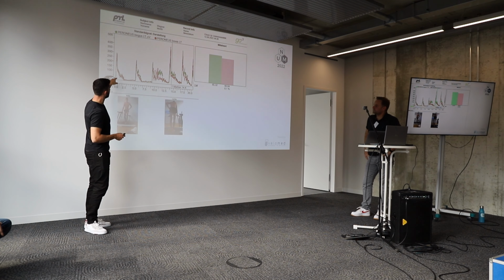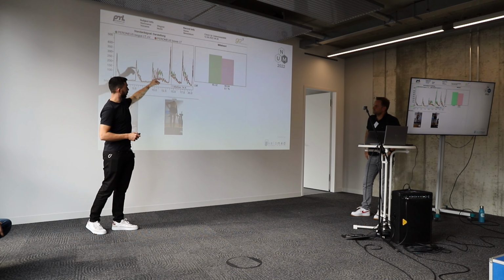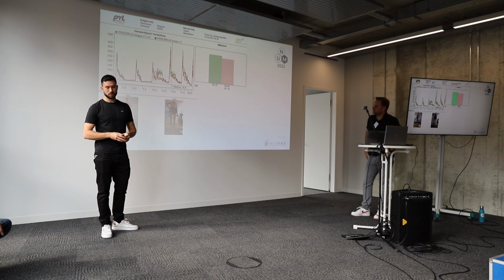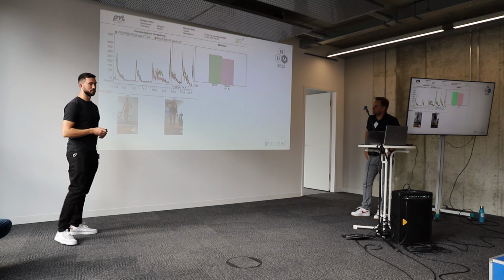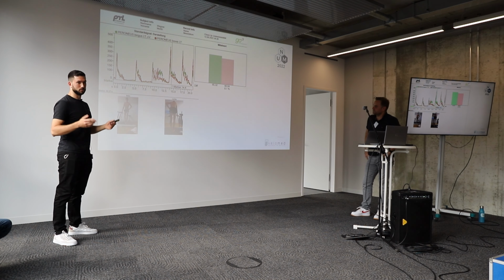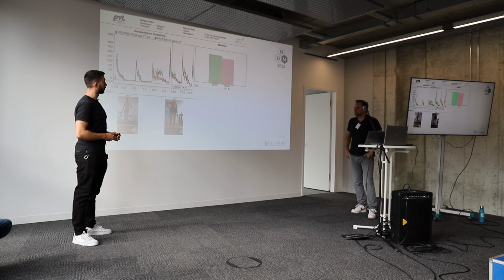and there's no difference between the long one and the short one, which is even more interesting when this is the same muscle. The muscle fibers are working differently in the upper and the lower part. This was just a test. Normally we just take the upper one, but this was very interesting to me.